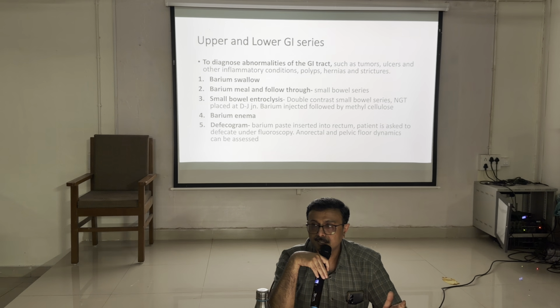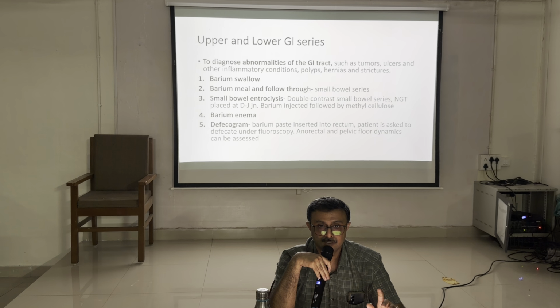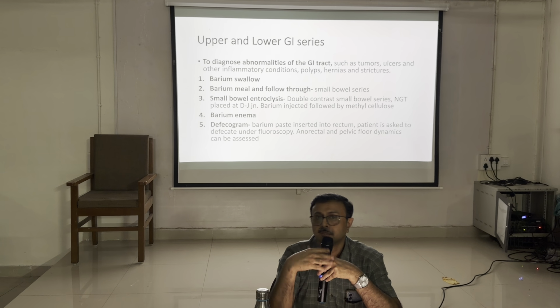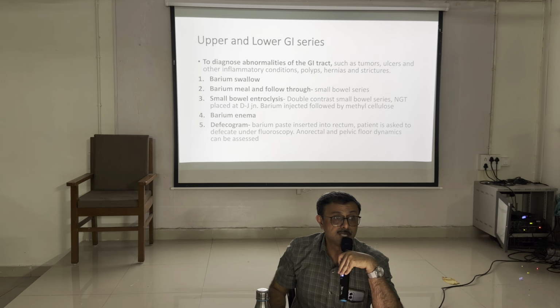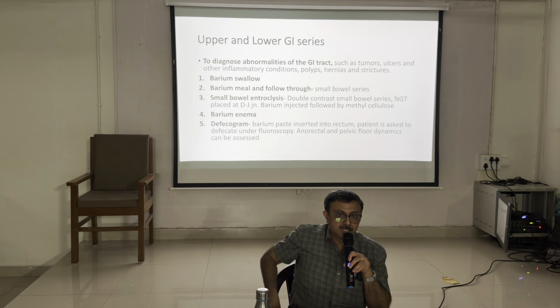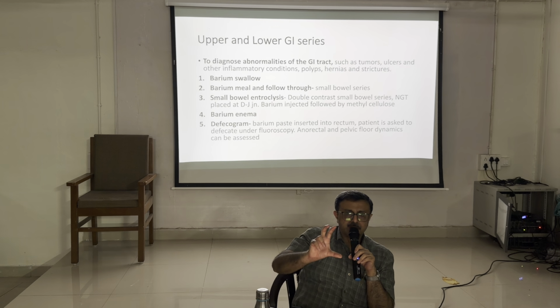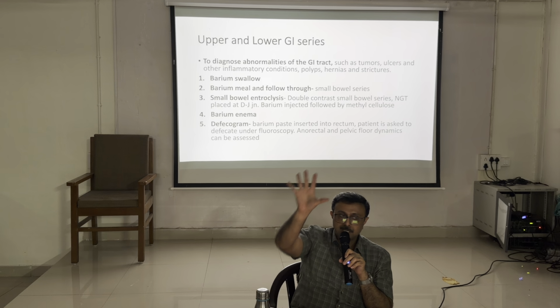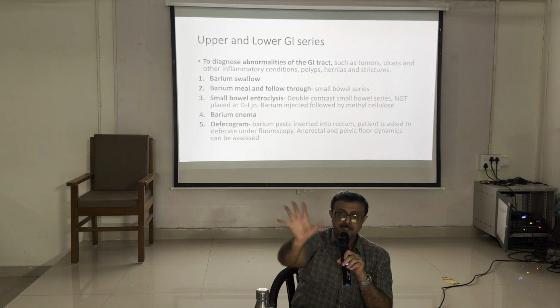Dye is injected, dye is ingested. Double contrast, single contrast, double contrast. Single contrast: the patient is taking barium sulfate, not barium phosphate. The patient is ingesting barium sulfate in a glass. It is the thick paste. It just ingests, now it is passing. In real time, pictures are taken.